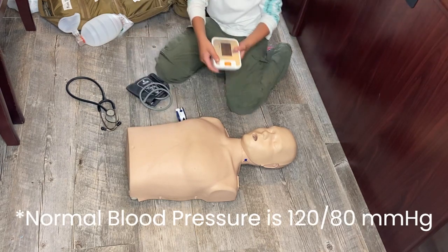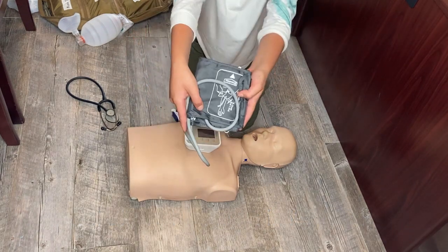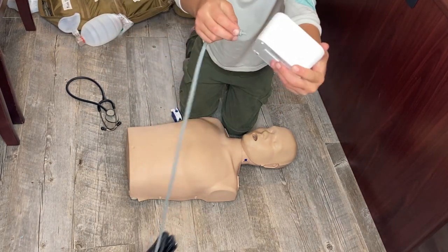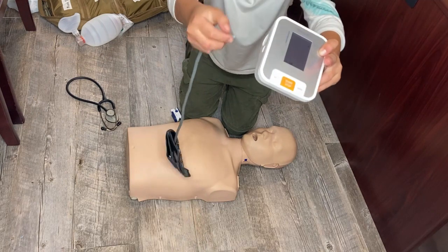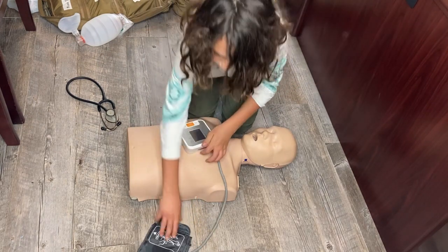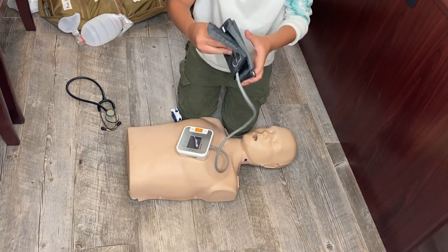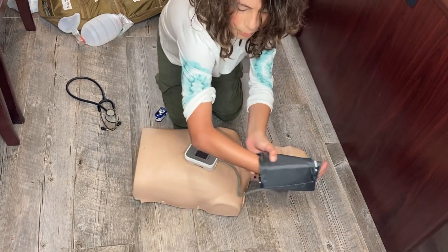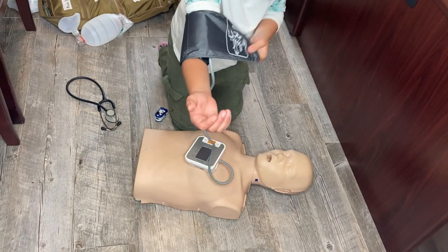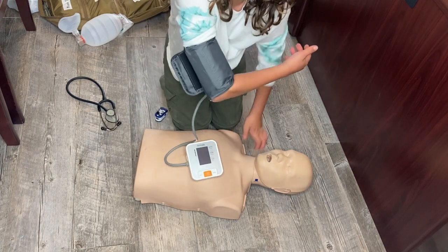For blood pressure, I'm using an electrical blood pressure cuff, and I have the attachments for the blood pressure cuff. So you take the blood pressure cuff and attach it right there. All right, and now it is attached. Then you want to lift up your shirt and put the blood pressure cuff all the way up on your arm. But I can't fit it on because I have a jacket. And then you would press start and hold it up to your arm like that.